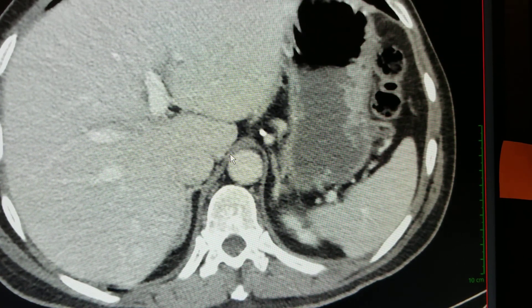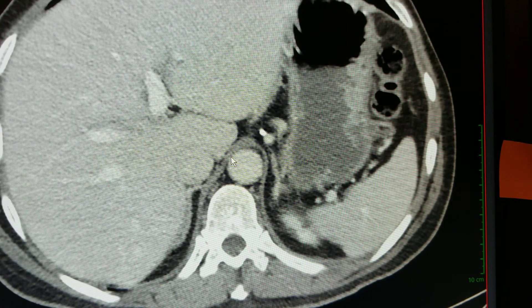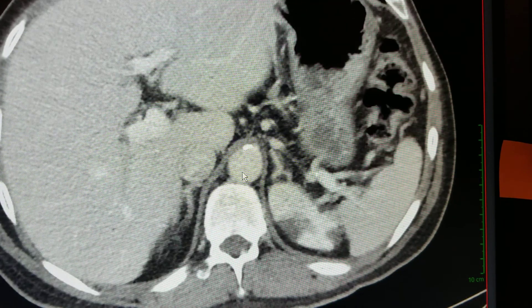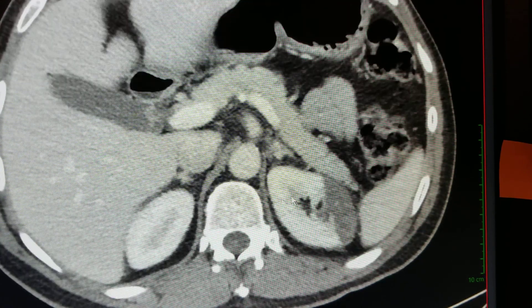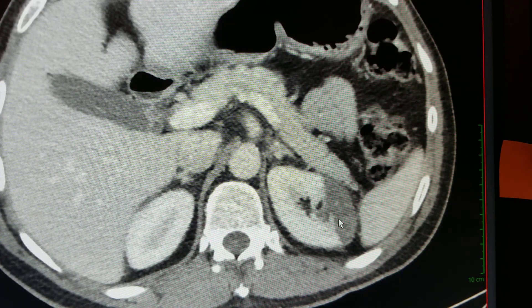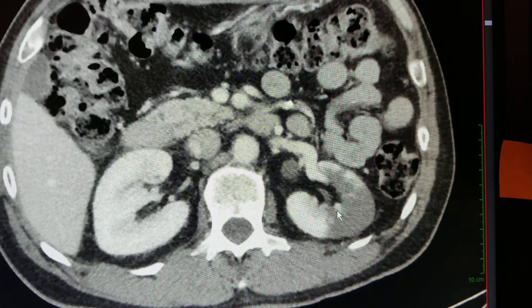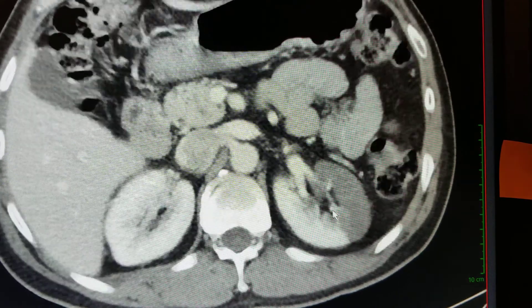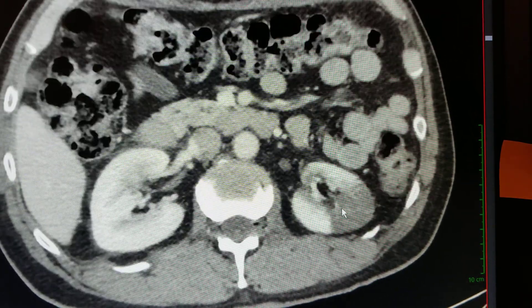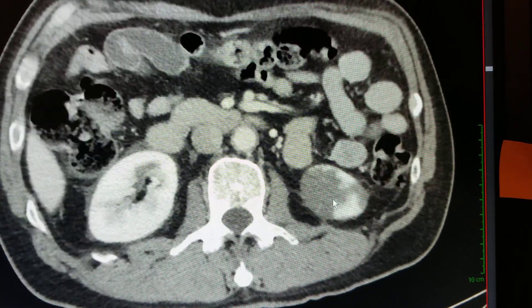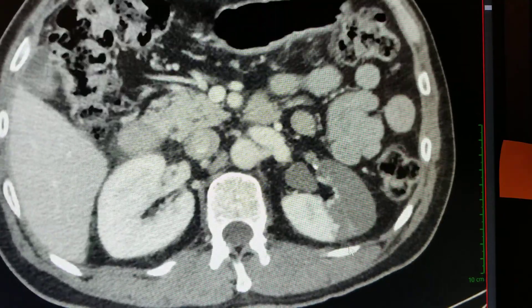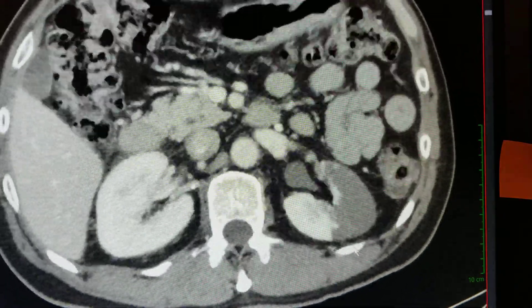Here we have a 55-year-old man that presented with left flank pain. Going through the images, we can see the left kidney, and there's a large area of lack of enhancement. It's geographic, and in some areas wedge-shaped, as you can see. It really affects the anterior half of the kidney, and inferiorly, the lower kidney anteriorly.